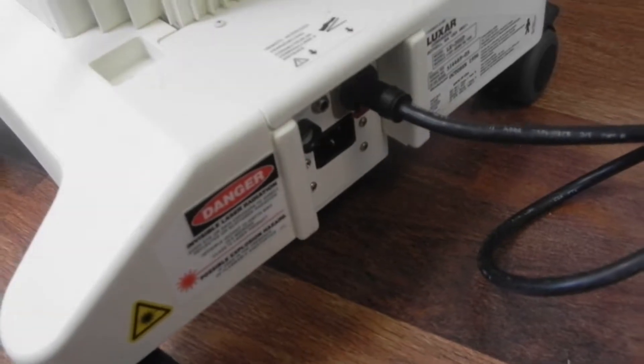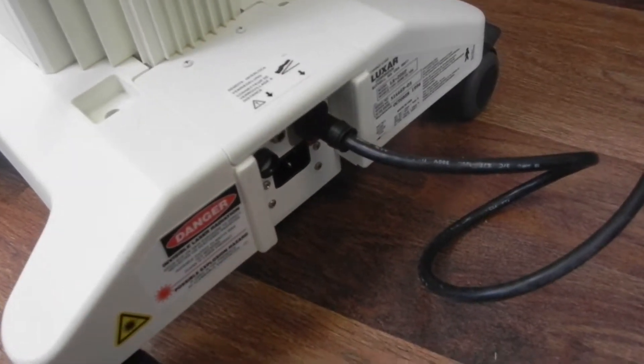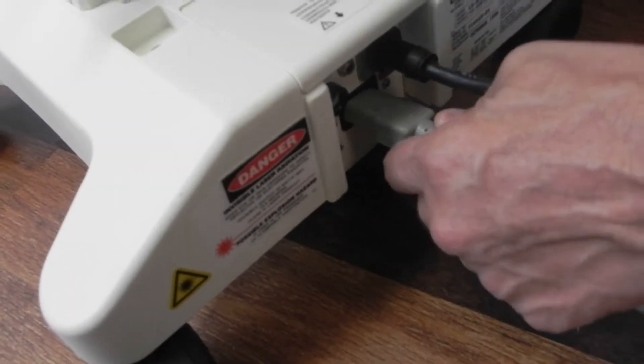In your accessory box you'll have the power cord as well. Go ahead and just unpack that, and then it'll plug in right into here.